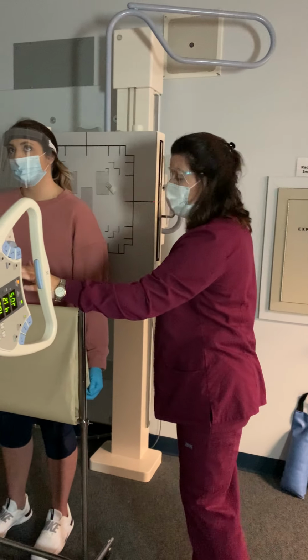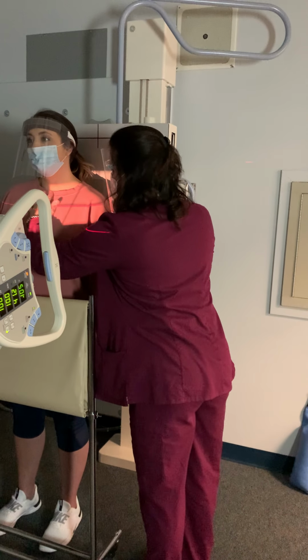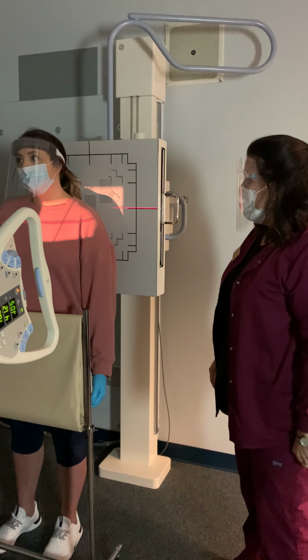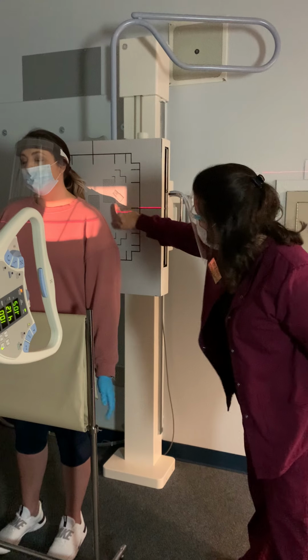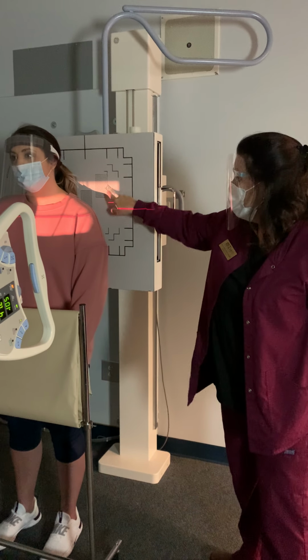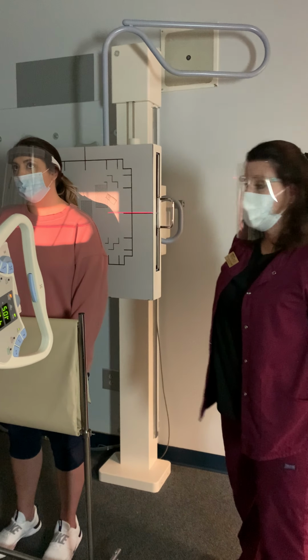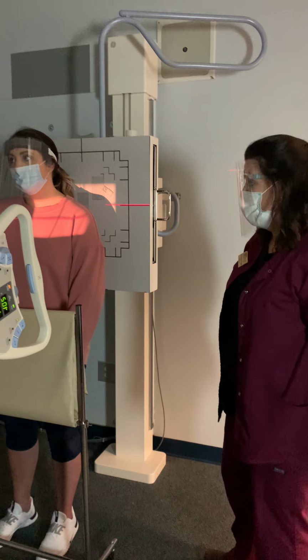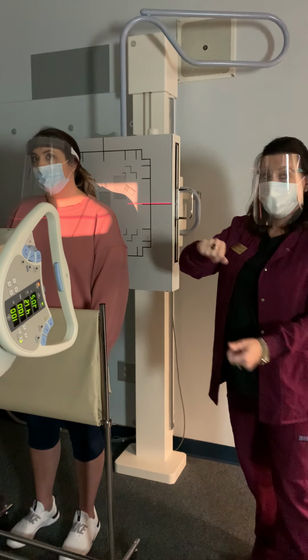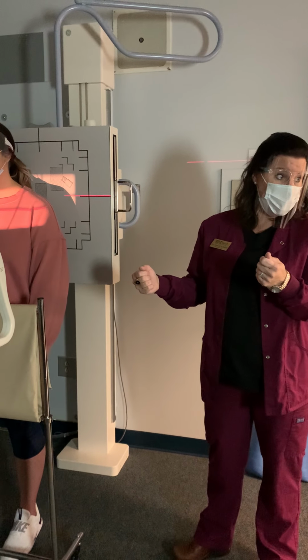So we're going to tell our patient, take a big breath in. Hold on, we slid over a little bit. There you go. Take a big breath in, hold it in. Beep. You can breathe and relax. When she takes that breath in, you watch that shadow, y'all. Make sure that your marker does not get in that shadow. Keep that marker high enough so it does not get in there when she takes the big breath in. For PA axial, we flip that angle caudal instead of cephalic.